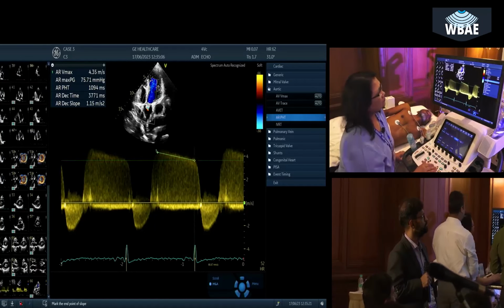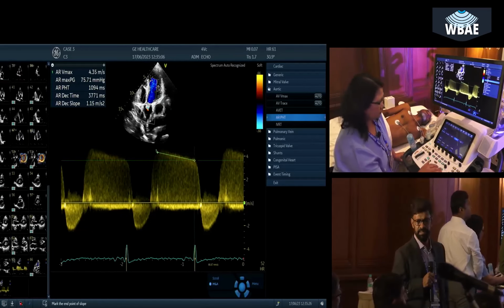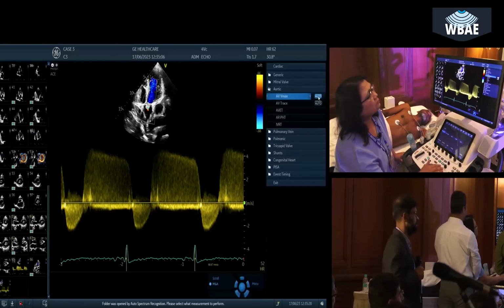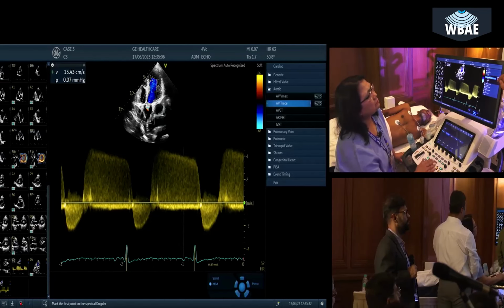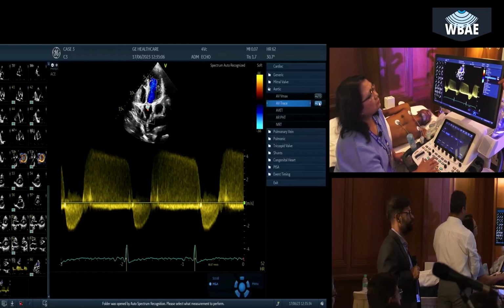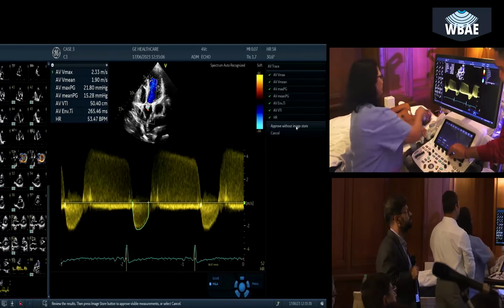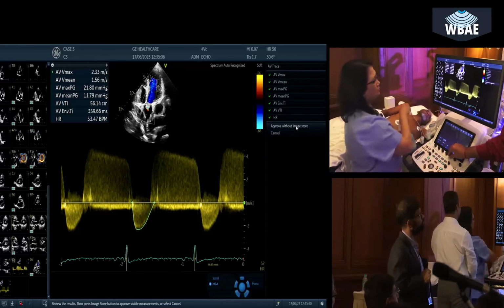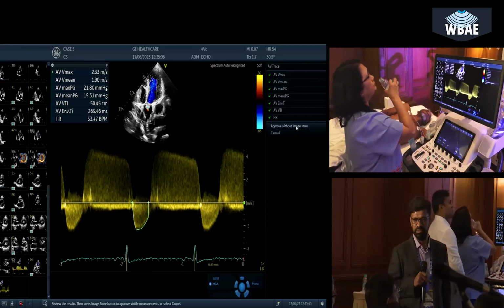How much does it come to? Something around 1,000. It's more than 500, so it is mild. And there is some gradient. But remember, the mitral stenosis will reduce the gradient of the aortic valve, and aortic stenosis will reduce the gradient of the mitral. So the mean here is around 15. This is evaluated low because of MS.